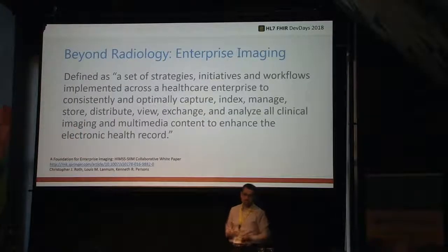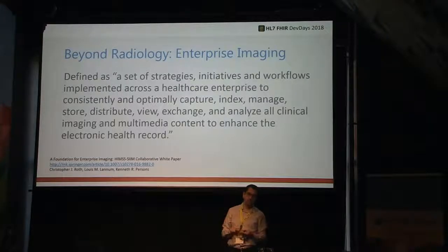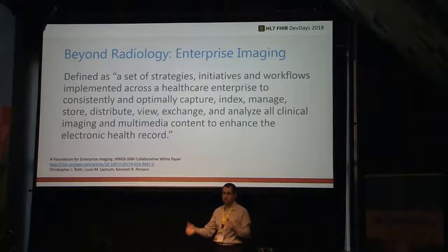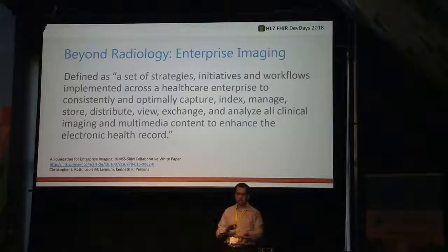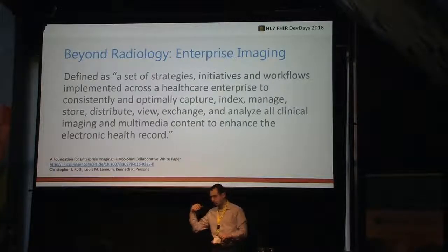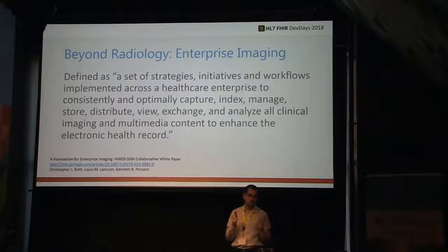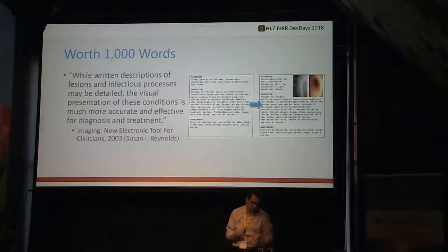And of course, a lot of people tend to think of imaging as radiology, but that's old-fashioned thinking. Imaging is much more than just radiology. We live now in an age where enterprise imaging is really the buzzword around the corner. And enterprise imaging means any image captured in healthcare settings should be part of the patient's record. So dermatology images, the patient has a rash that's captured, pathology, et cetera, all of these things should be stored and tracked. But of course, properly stored. It's not just a file, it has to be linked to the patient's record, and that's the trick. This is where DICOM comes in pretty useful.